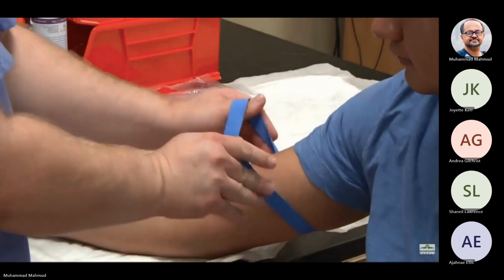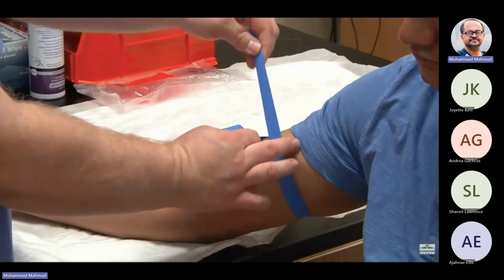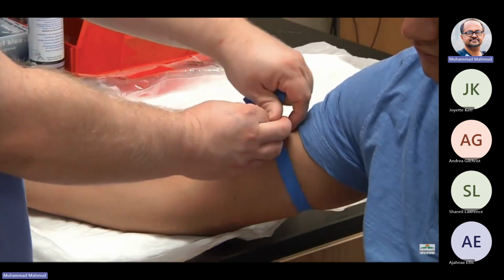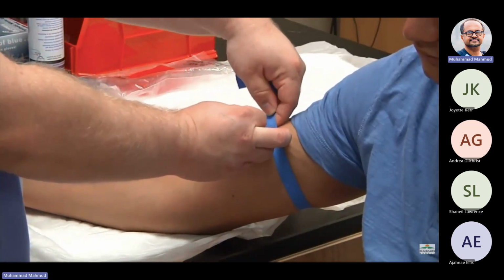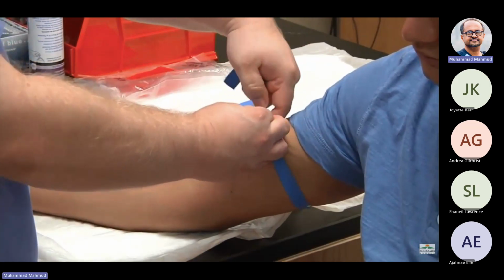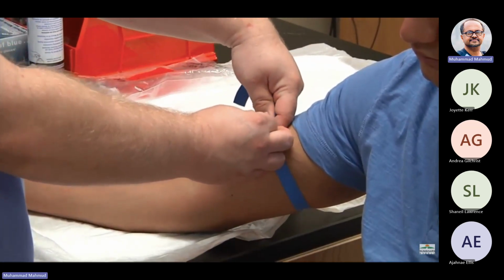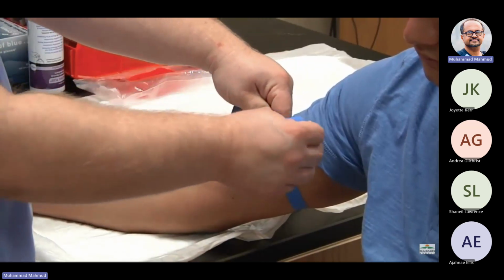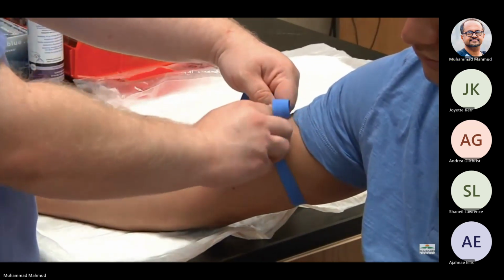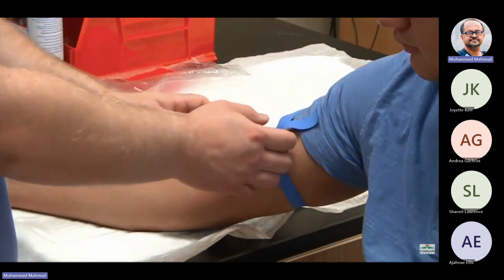With my non-dominant hand, I'm going to position the strap on the back side, give it a pull, place the pointer finger of my non-dominant hand underneath the tourniquet, pull with my dominant hand, and tuck under, leaving a little tab to release the tourniquet.